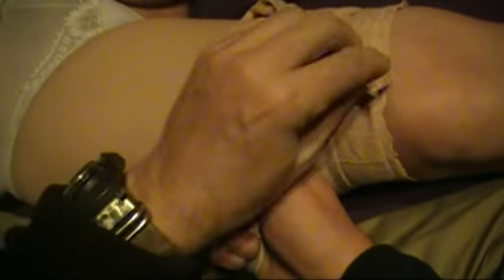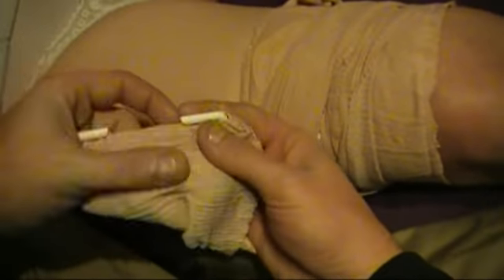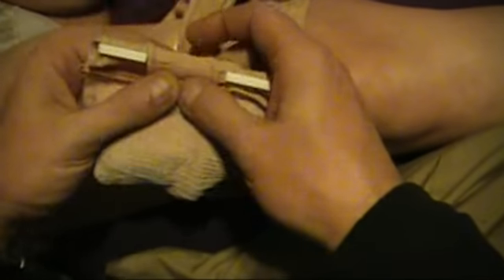Okay? And then when you get it all the way to the end, that's when the little clippy thing comes in play and you slide it under and it clips in place. Or if you've got a knife, you can also split this so it's two pieces of cloth and then tie it around and tighten a knot.